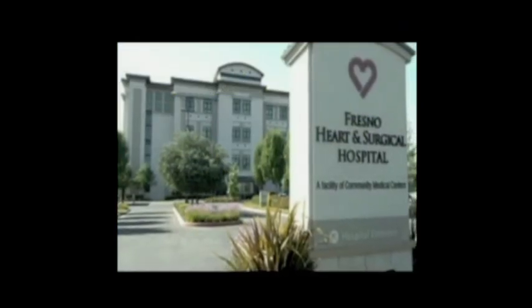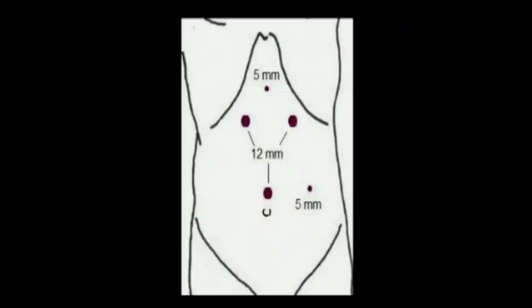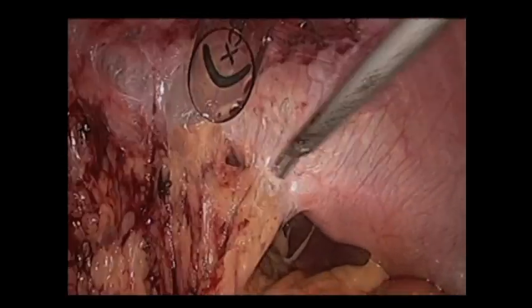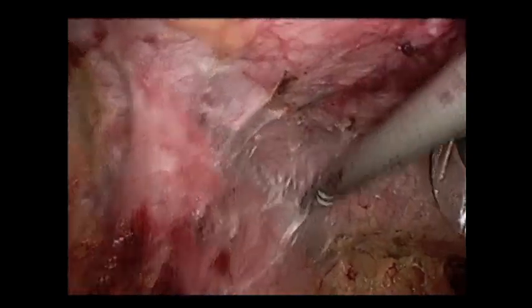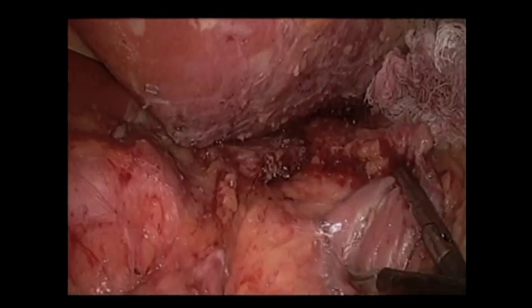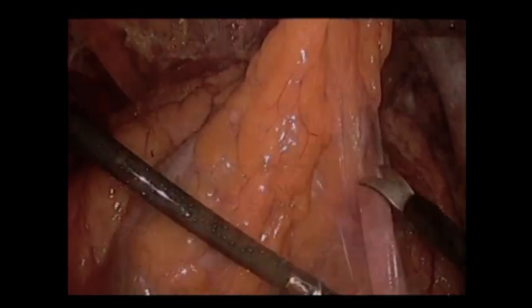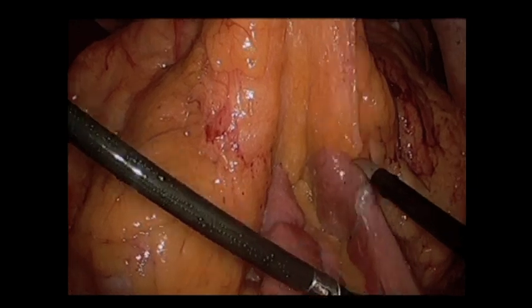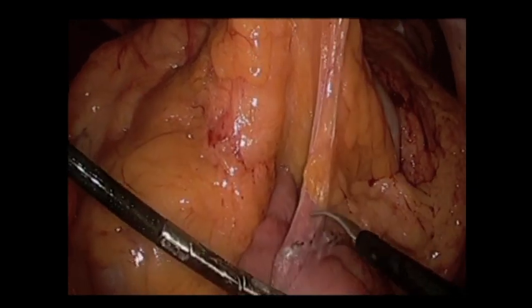The next diagram will show our trocar placement. She was taken to the OR, and as you can see, there were extensive adhesions, especially in the left upper quadrant of the abdomen. These were all taken down using the harmonic scalpel. We identified the retrocolic Roux limb and dissected it out to make sure that the limbs were of appropriate length.